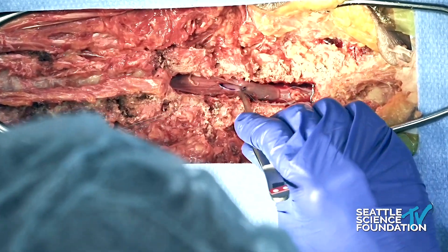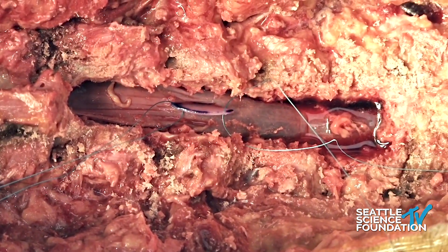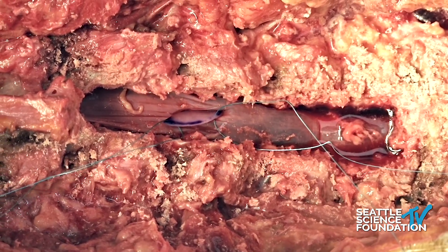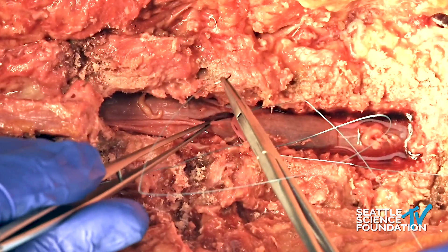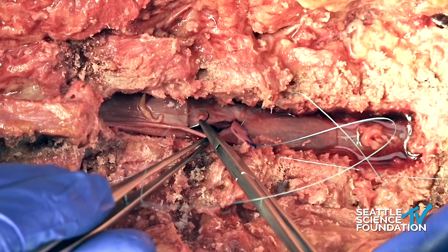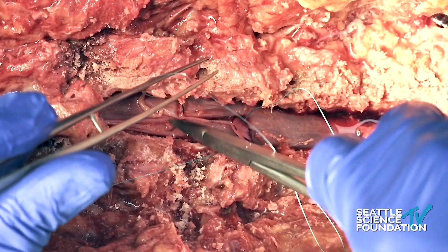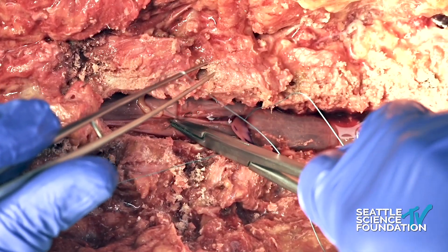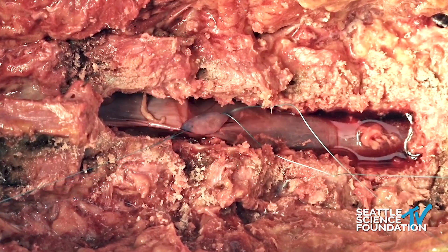So we lower the dural patch over the durotomy and we'll begin securing the graft to the native dura. When we suture, we suture from the graft to the host to make sure that we get the graft to parachute underneath the native dura.